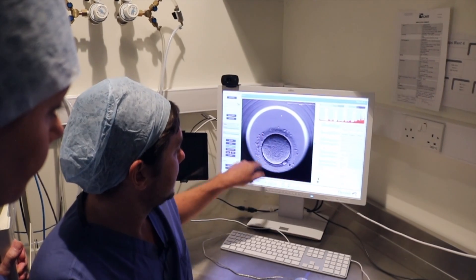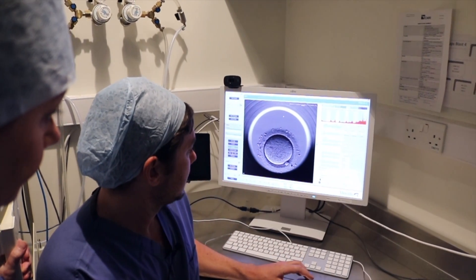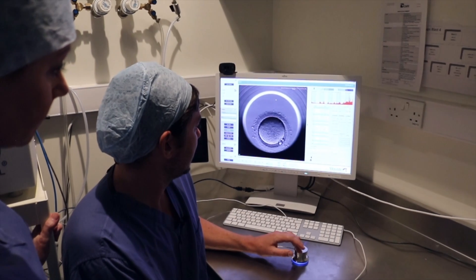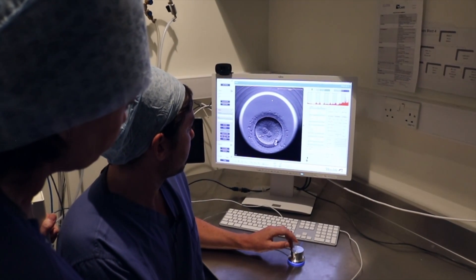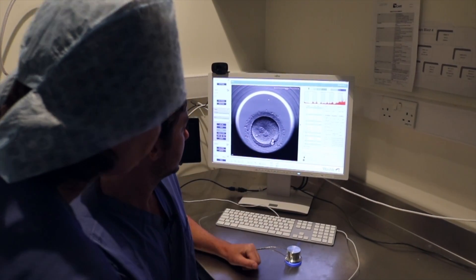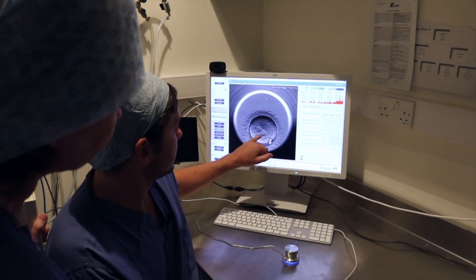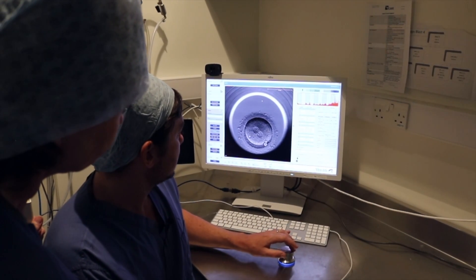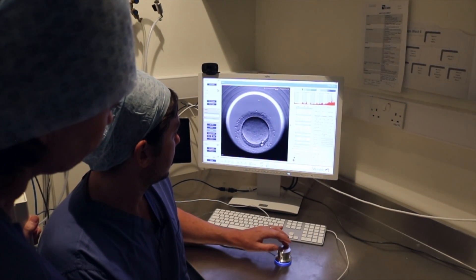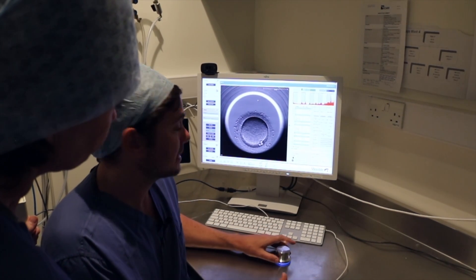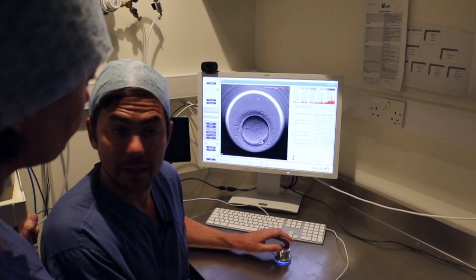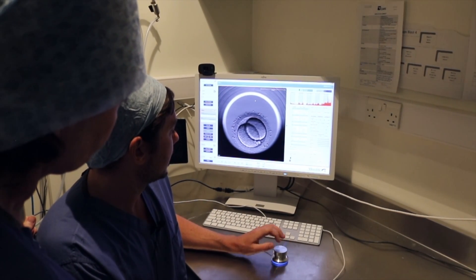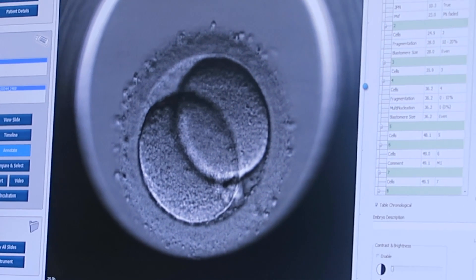This is the egg sitting here that we've just injected. Using the time-lapse imaging we can move ahead and we can see if the egg fertilizes. We know that by the presence of these two dimples just here — this refers to mum's DNA and dad's DNA. As the egg develops these fuse together and disappear, which signifies the start of embryo development and successful fertilization, followed quickly by the development of that egg into a two-cell embryo.